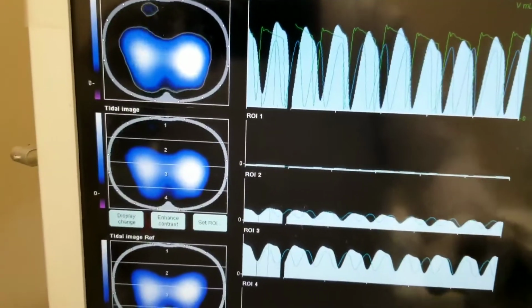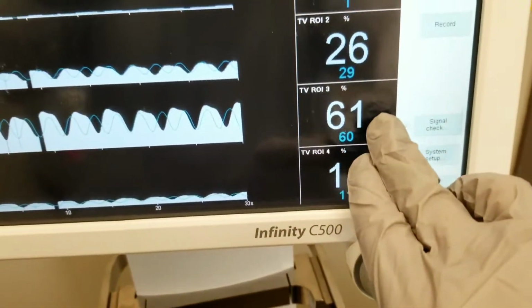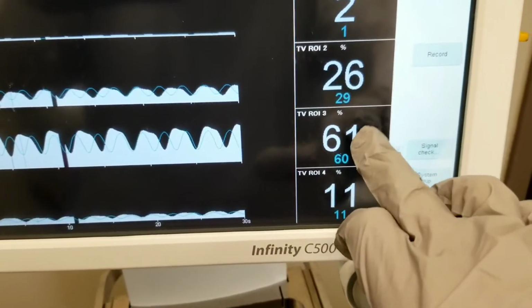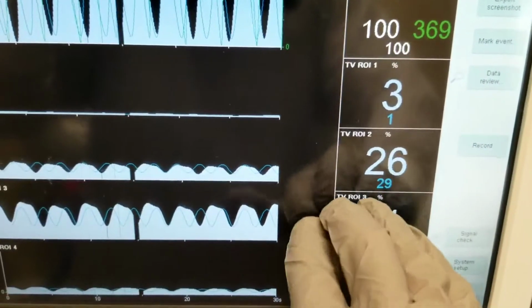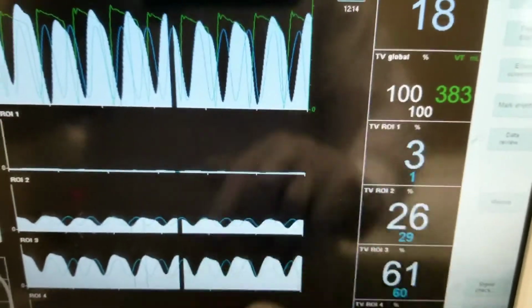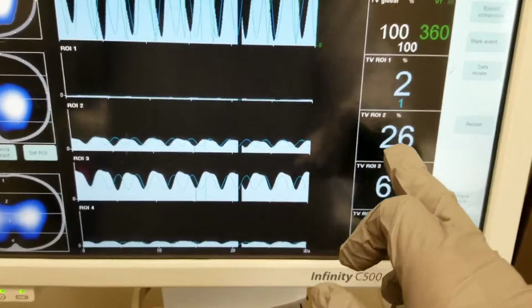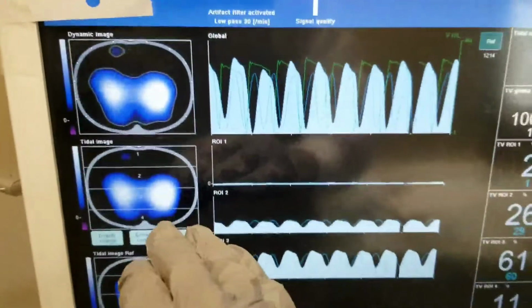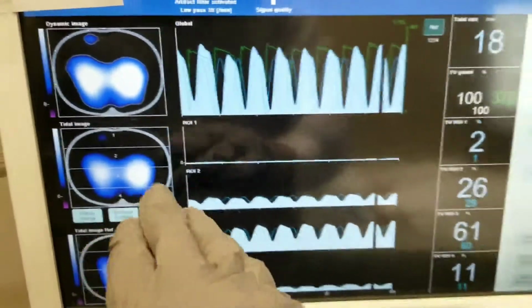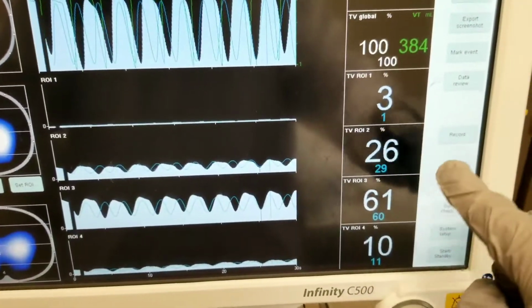This is good, but there's nothing wrong with having this number at the mid-dorsal region starting to be redistributed up here to have a more homogeneous distribution of ventilation. So that's why we were seeing previously on the end expiratory lung impedance a lot of gain in this region.